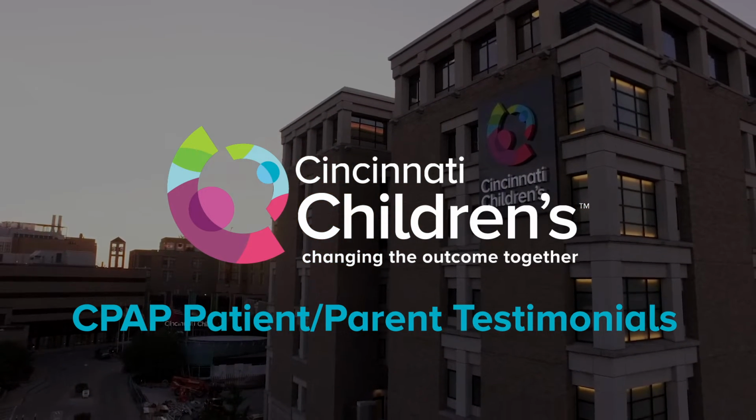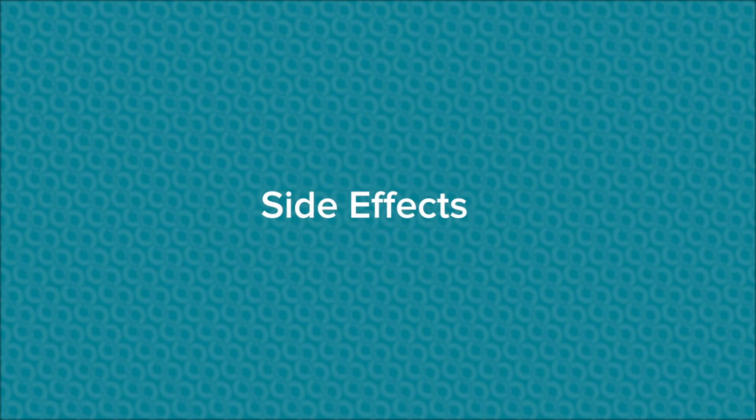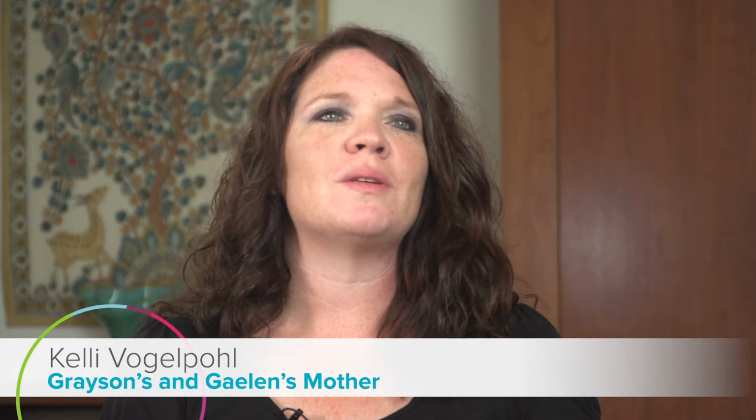Families often have good advice on what worked for them as their child adjusted to treatment with CPAP or BPAP. Occasionally there'll be a pressure sore, not an open sore, but just a red mark that maybe will stay. It tends to be when the air is a little drier, so we just make adjustments and make sure that the mask is fitting okay.